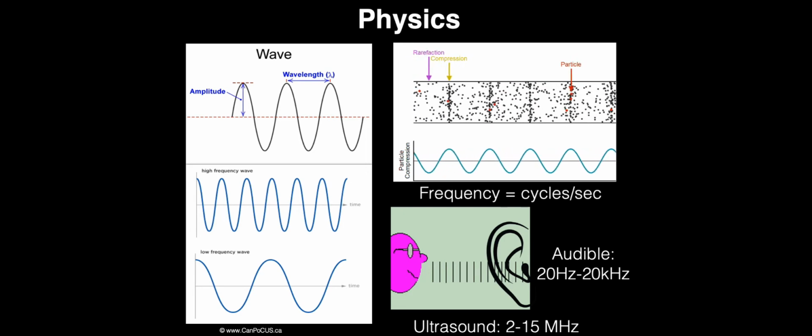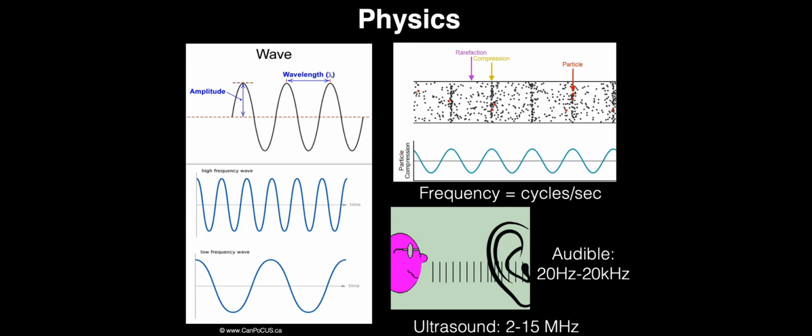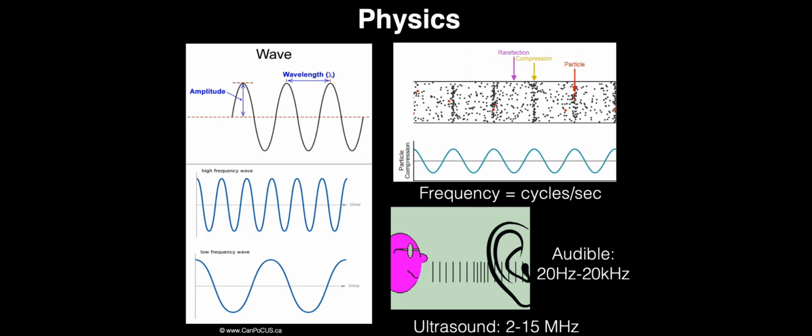Ultrasound is measured in megahertz. The frequencies are therefore 1,000 times higher than audible sound.